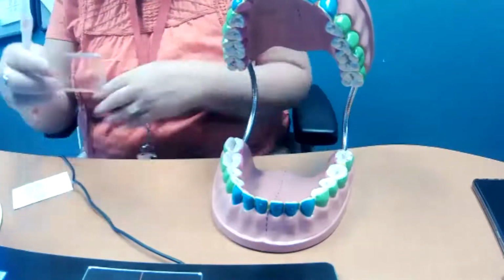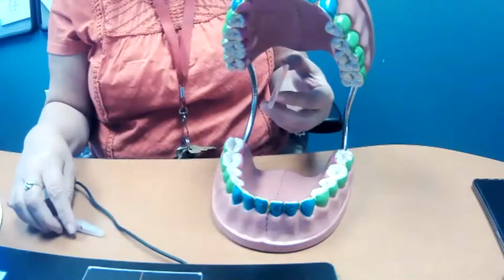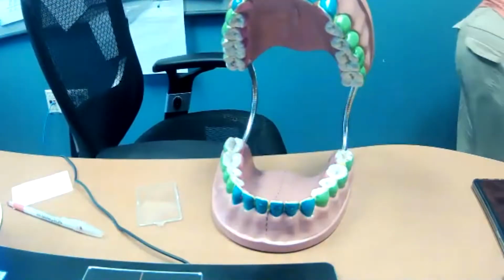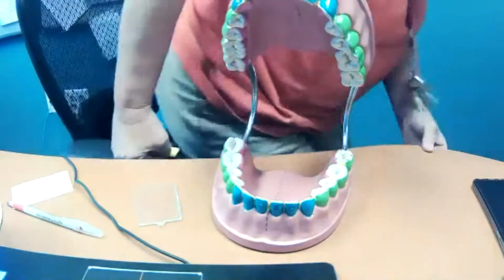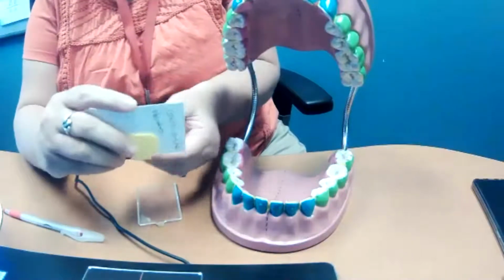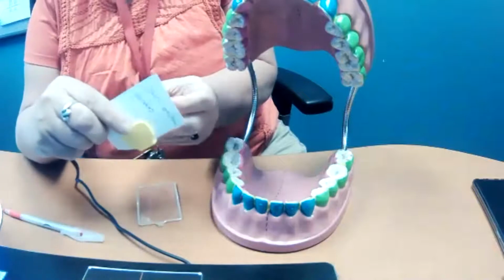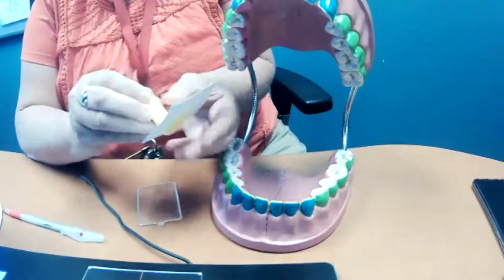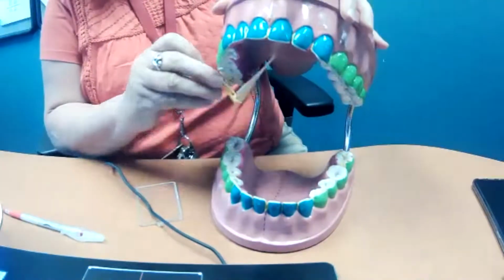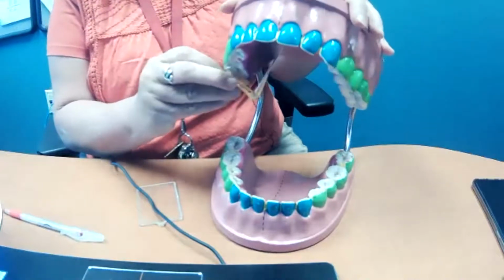Okay, I have something a little bit harder. So what's going to happen is that I don't have a film holder here with me. I've got this. So this is the bite block for a conventional XCP. So your film would go in here, and then it would go in here. And so what's important is that on the palate, on the maxillary, you'll put your film here and then have your patient close.